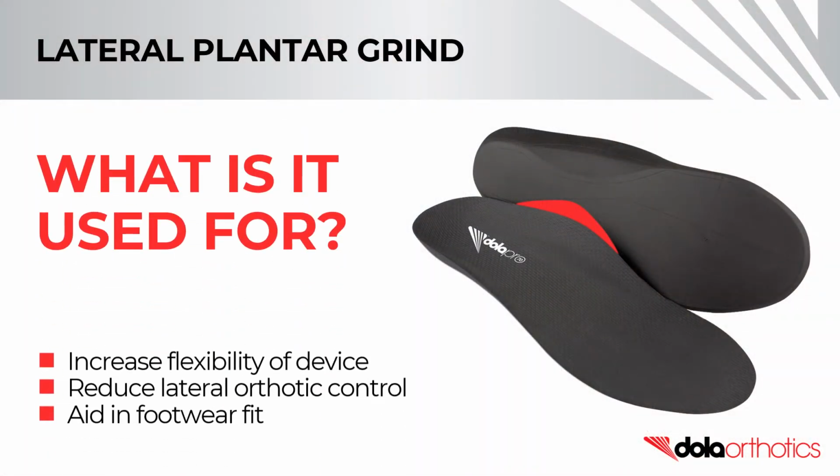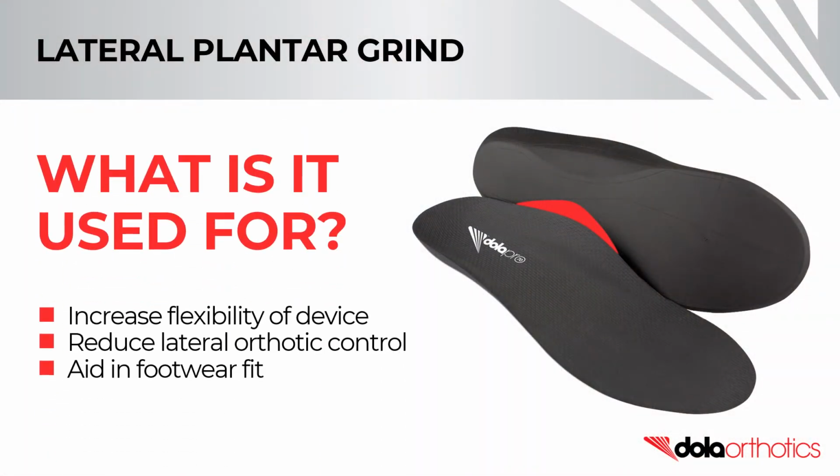A lateral plantar grind is used to increase the flexibility of the device, reduce the lateral orthotic control by reducing the lateral arch reinforcement and the size of the flat plantar surface, and it can be used in aiding footwear fit including football boots, cycling cleats, ski boots, dress shoes, high heels, street shoes, and narrow-waisted sport shoes.